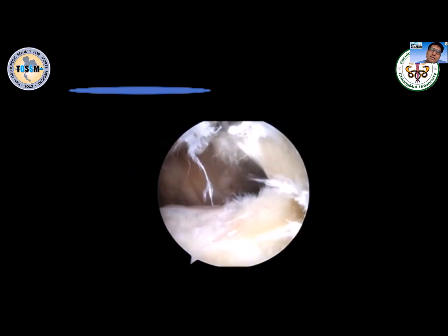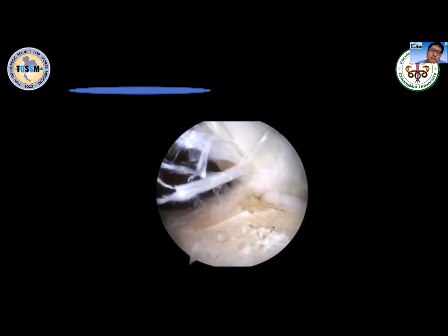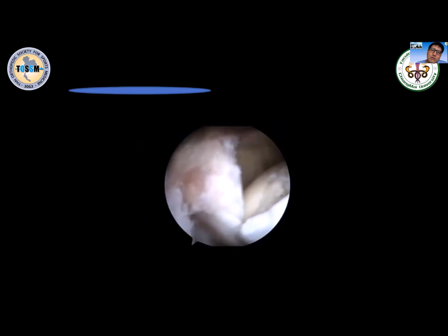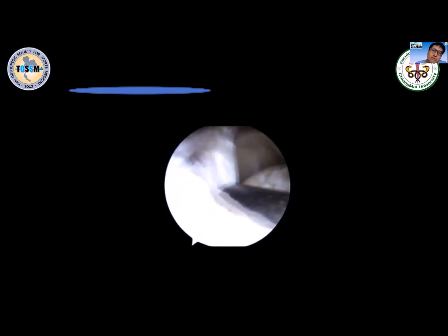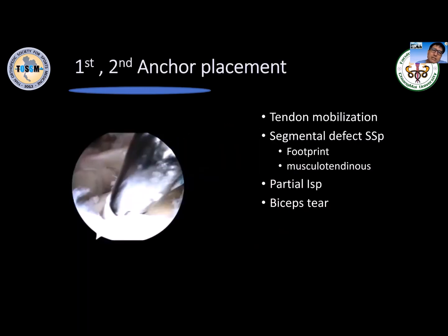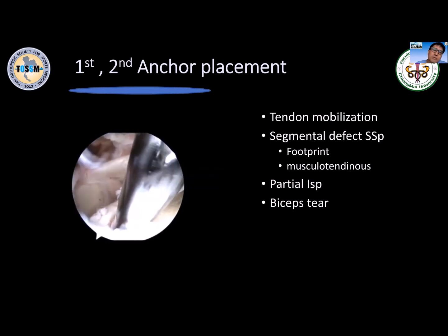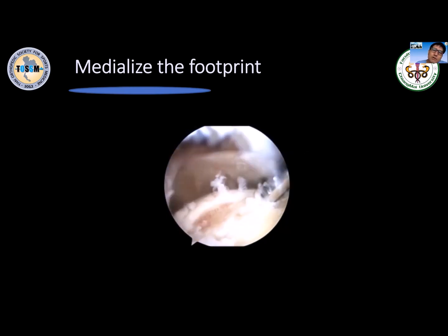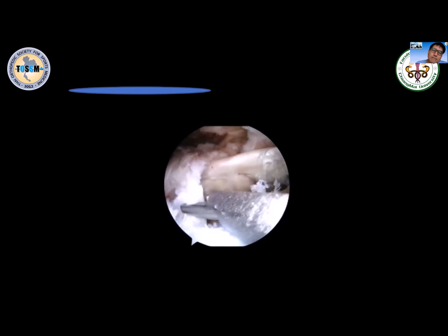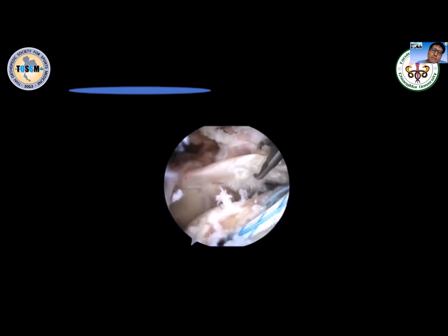It's degenerate right there. Some people say, hey, this is not a good bicep, should kill it. Now I'm thinking about what we should do. So first, what I did, I divide the infraspinatus, and then I put the anchor. This is for repairing the infraspinatus, and this one is almost on the middle of the humerus, just to repair the biceps.